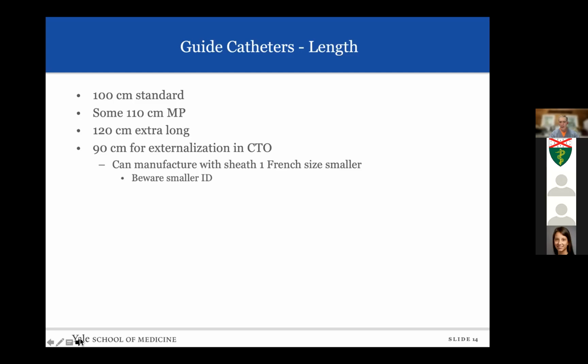It is pretty flimsy. You shouldn't torque it based on the collar. You have to torque it above where the graft has been placed that you just put in. But in a pinch, it does work out.